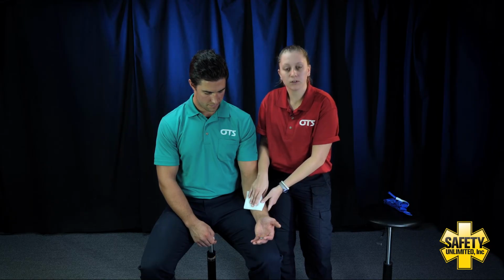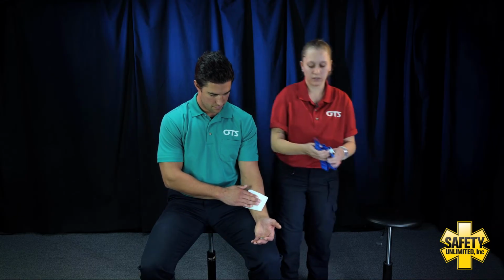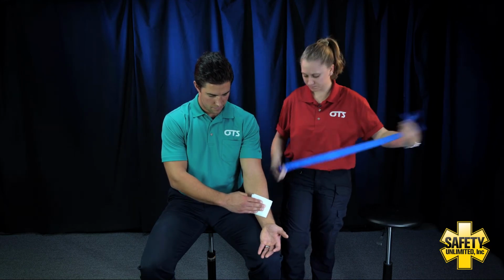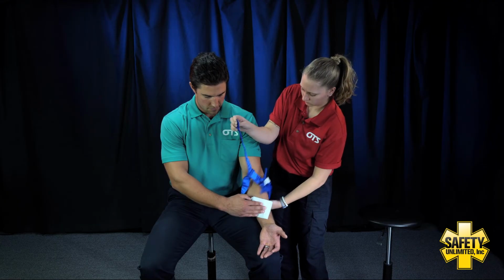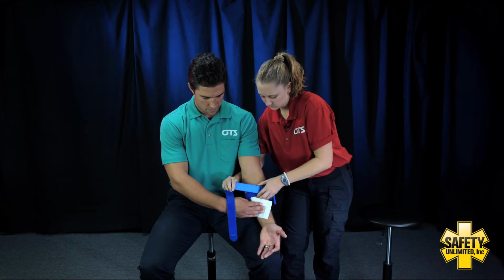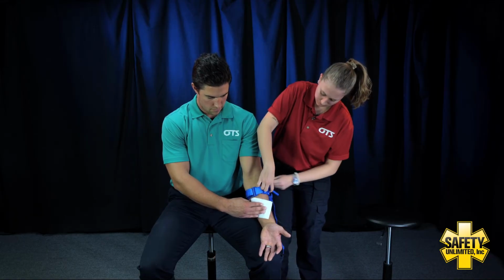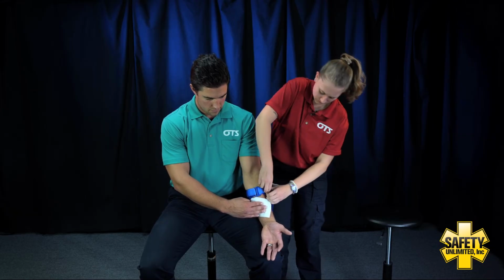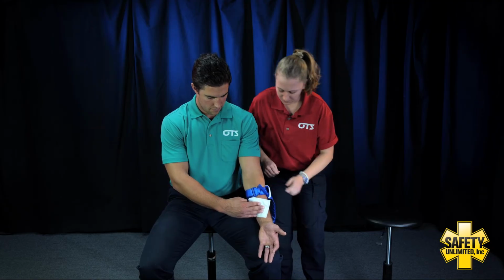Okay, since this appears to be an arterial bleed, we're going to go ahead and grab our tourniquet. If you could go ahead and hold that gauze in place for me. So with our tourniquet, we're going to place it 2 to 4 inches above the wound. So it's going to be about right there on his upper forearm. Okay, we're going to cover this up and I'm going to note the time I placed the tourniquet on.